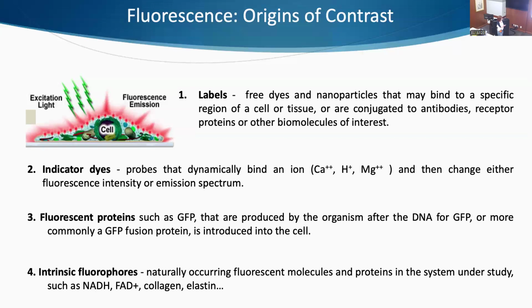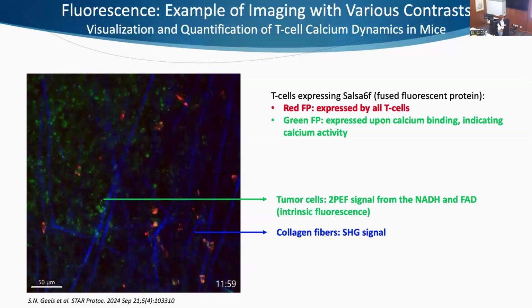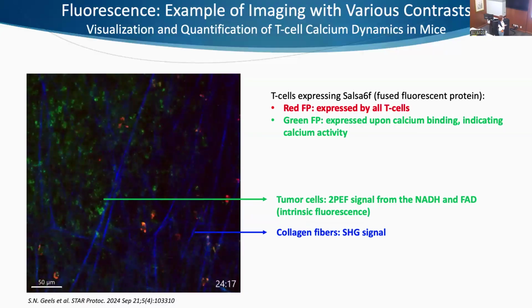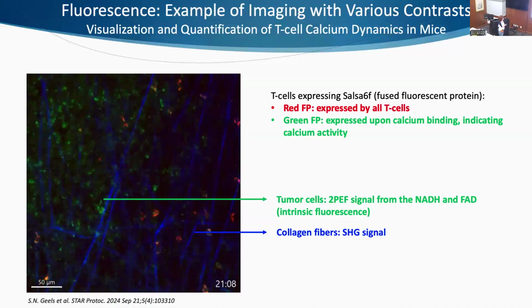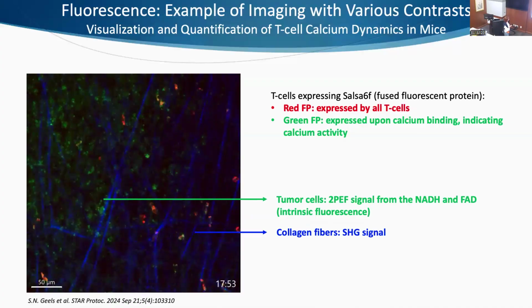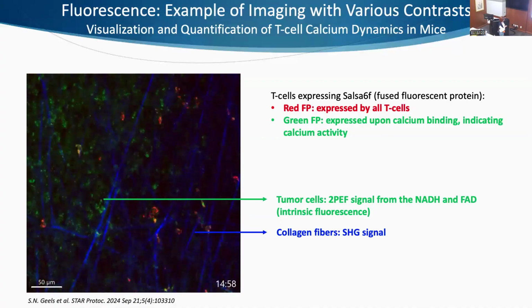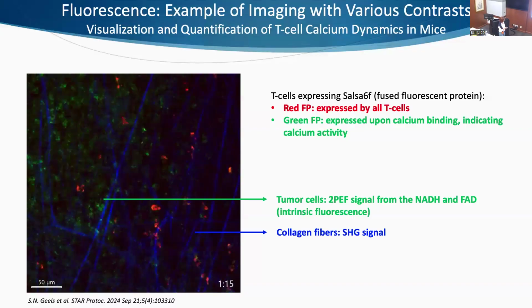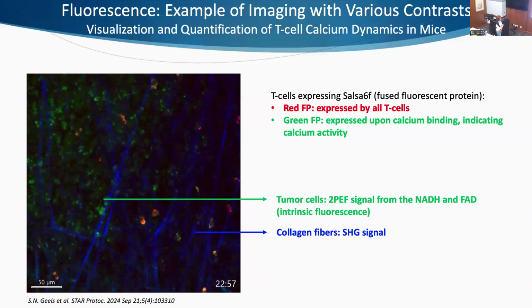So these are options for a contrast that we have, and I wanted to show you an example where you can take advantage of a variety of these contrasts. This is a time-lapse movie that was recorded in a publication by Professor Francesco Marangoni here at UCI.